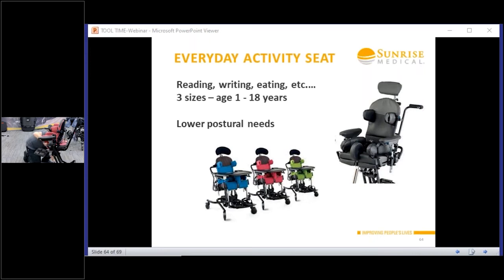This is a brand new chair, so all brand new products can be a little bit sticky, or as I call it, been put together with man strength, because often they'll use the preset pressure. There we go.